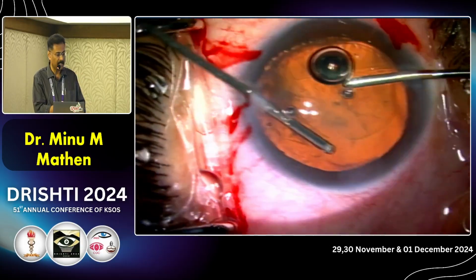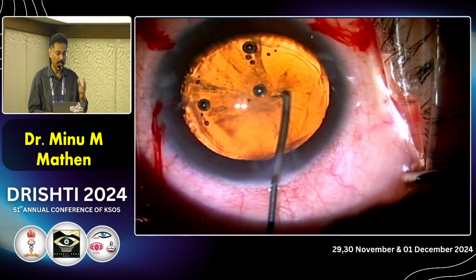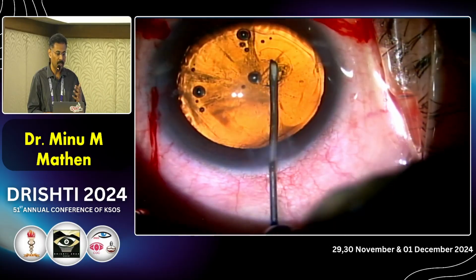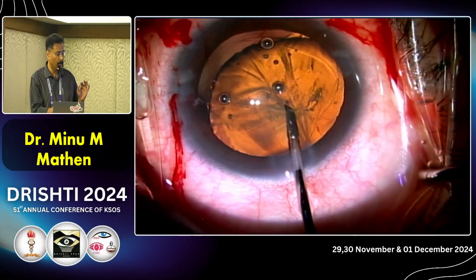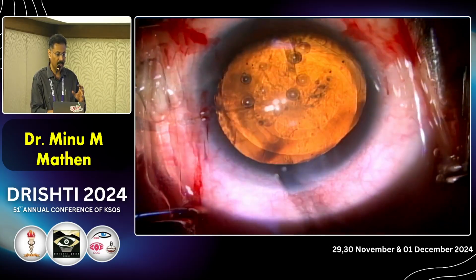Now a little bit of vitrectomy. If you find vitreous there, do a little bit of vitrectomy and clear it off. Don't do too much, don't pull too much vitreous from behind, you lose support. And the rexis is started, see the wobbly lens. There is less counter traction by the zonules and it's difficult.